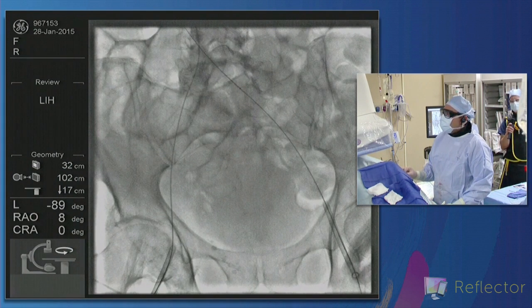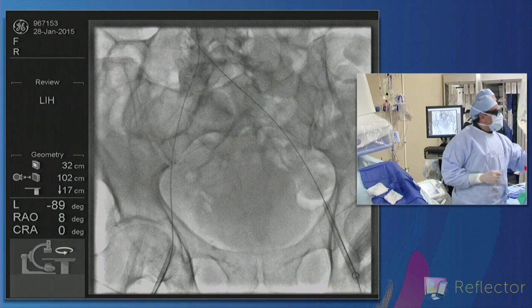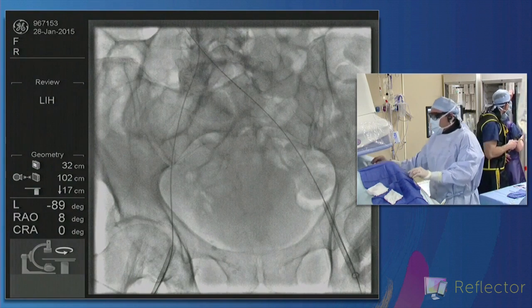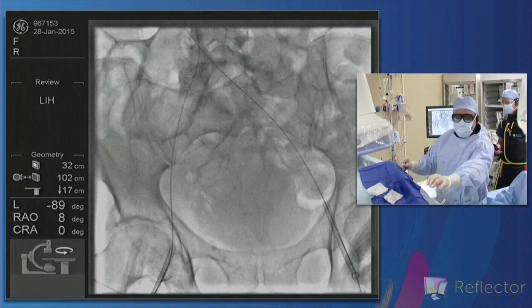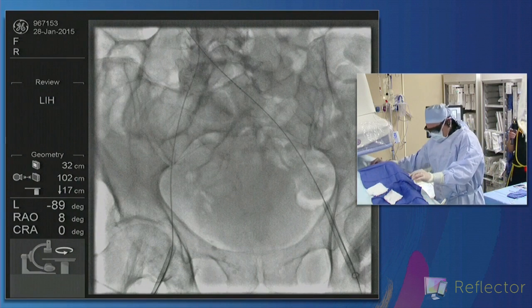And on the other hand, we always look at collaterals. If there are no collaterals, whatever our finding is, we do nothing. If there are collaterals, then we still want to know exactly where it is. And then a diagnostic ballooning is sometimes of help before we take the decision to stent it. But we never ever, if we treat something, we balloon as a treatment, we always leave a stent.